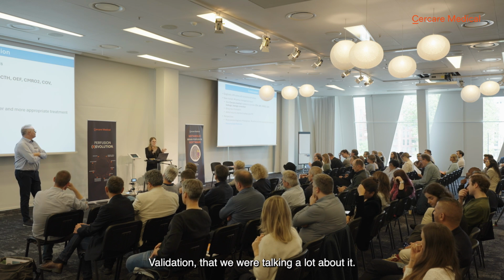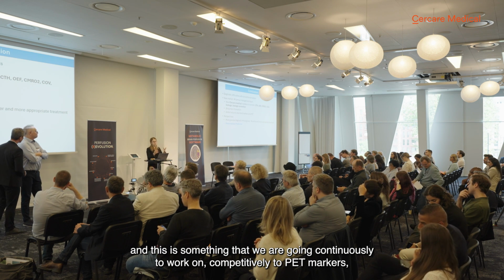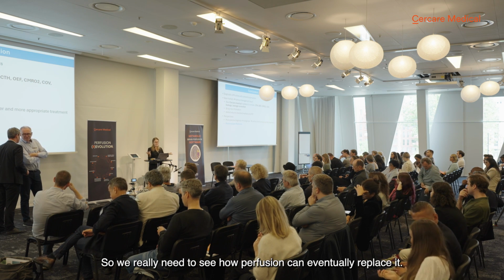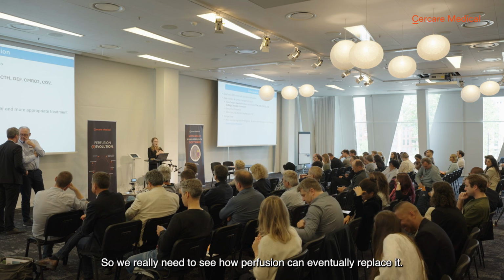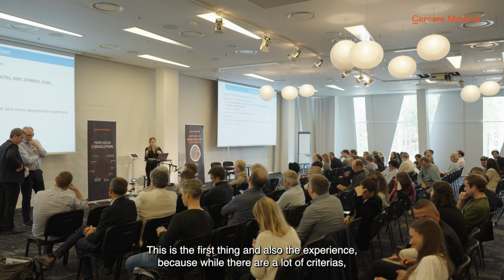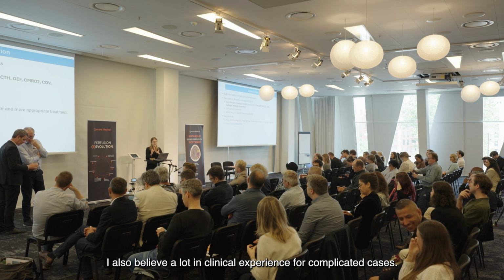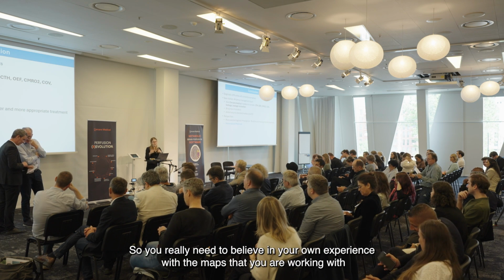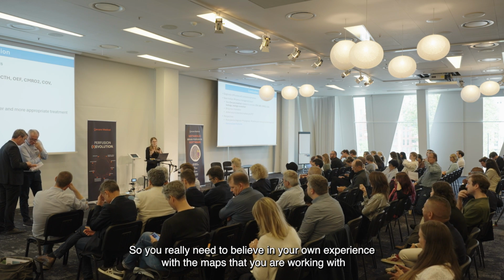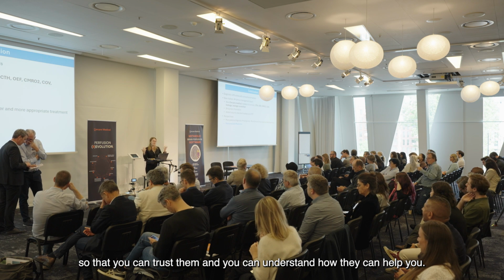A validation, which we were talking a lot about, and this is something that we are going to continuously work on, comparatively to PET markers, because as you were saying, not everybody has PET, so we really need to see how perfusion can eventually replace it. This is the first thing, and also the experience, because while there are a lot of criteria, I also believe a lot in clinical experience for complicated cases. You really need your own experience with the maps that you are working with, so then you can trust them and understand how they can help you.